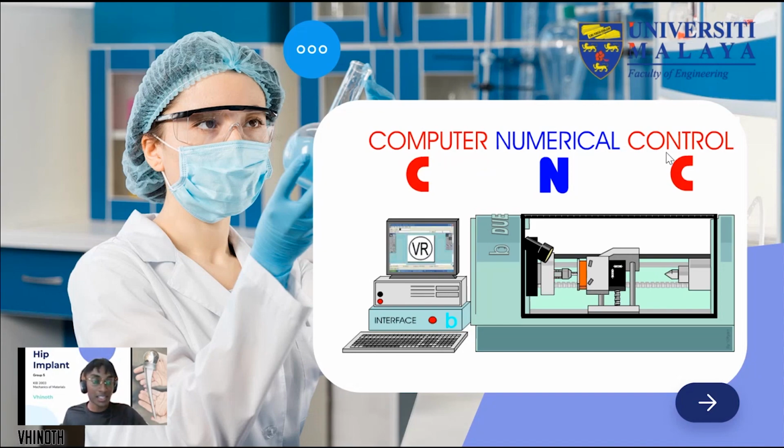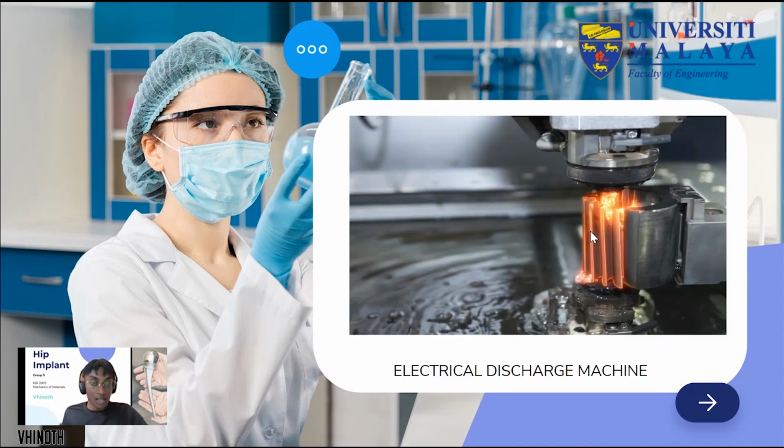Hence, traditional methods such as drilling, milling and grinding are less opted for, and can be replaced using an electrical discharge machine (EDM) or even a computer numerical controlled electric discharge machine, which is claimed to increase the precision in making hip implants and removes electrically conductive materials. The electrically conductive materials are removed into their targeted shape.